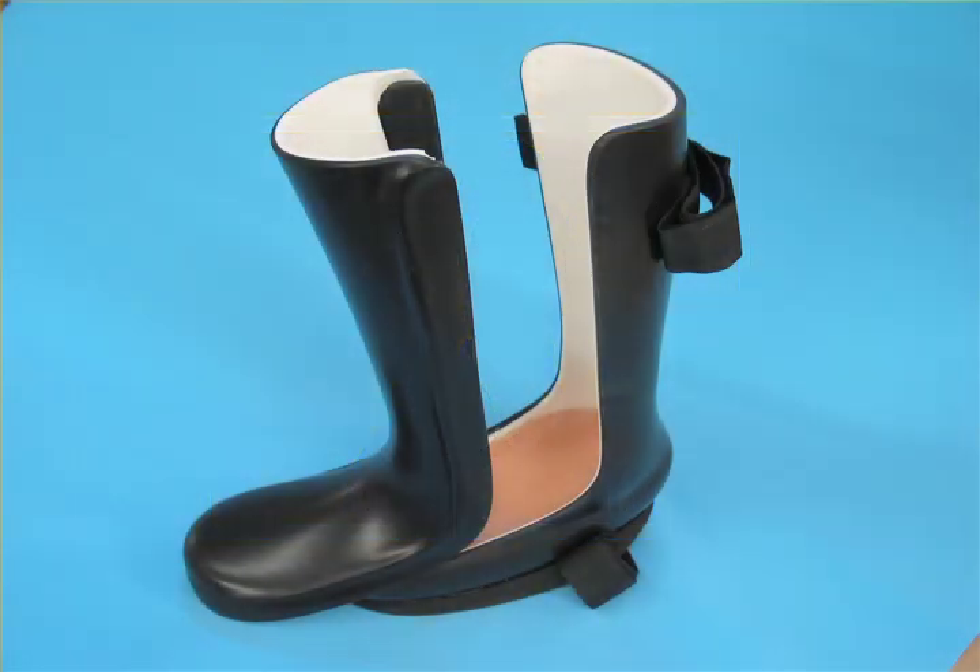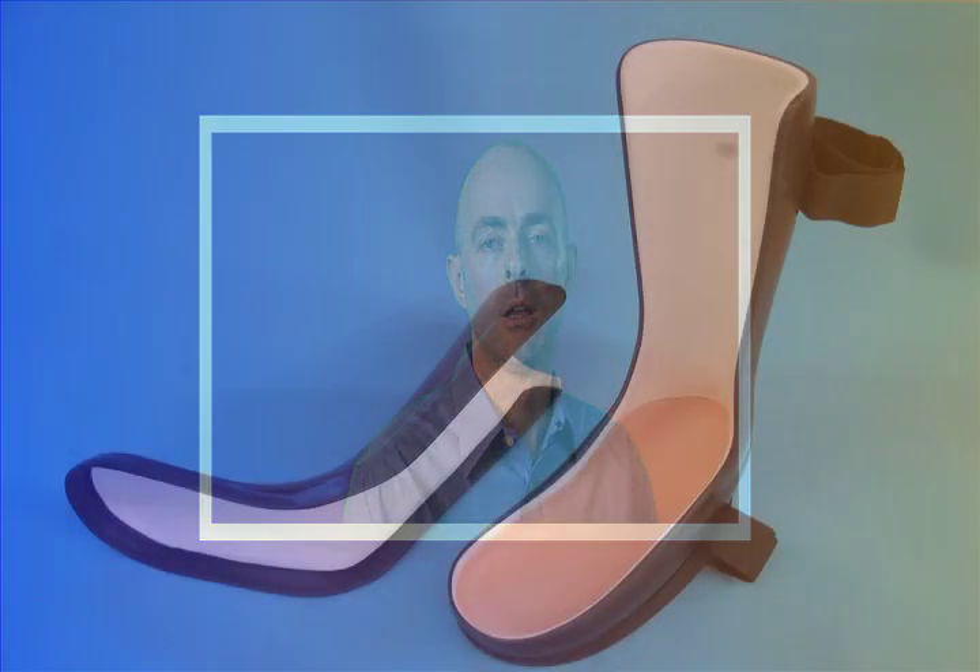In more severe cases, you can use a CROW walker. This is essentially a rigid, custom-made polypropylene boot — a shell that protects the foot, reduces or locks range of motion at the ankle, and allows for an extra depth inlay which can be relieved and given depressions and pads in order to take the pressure off specific areas of the foot.